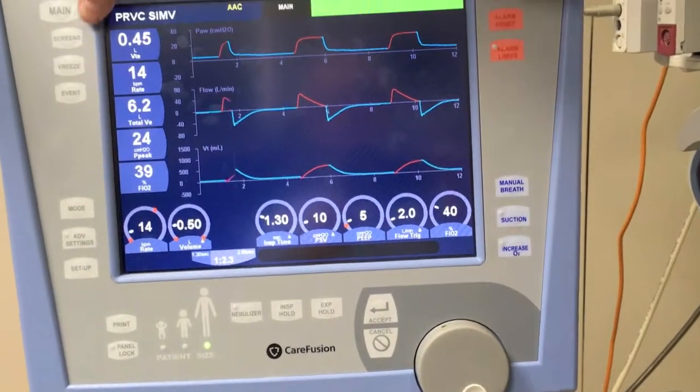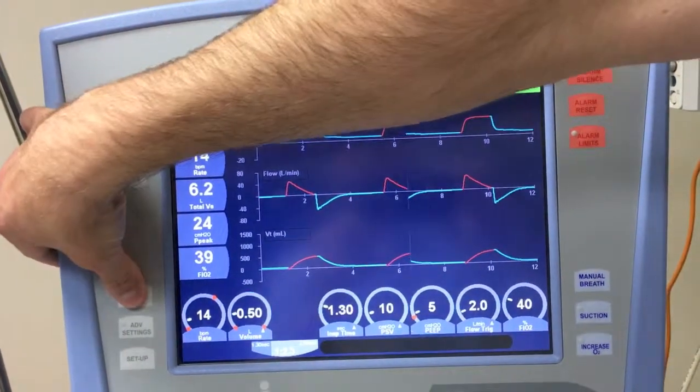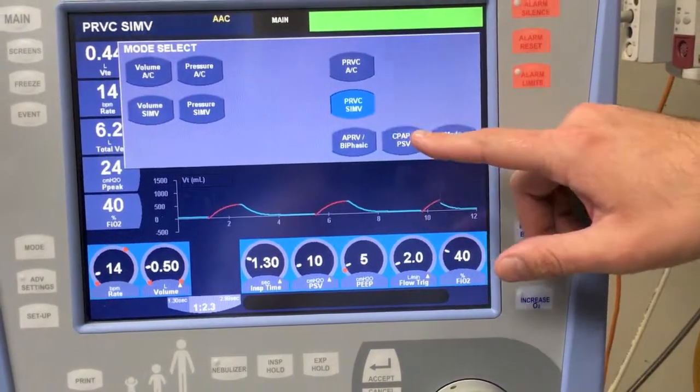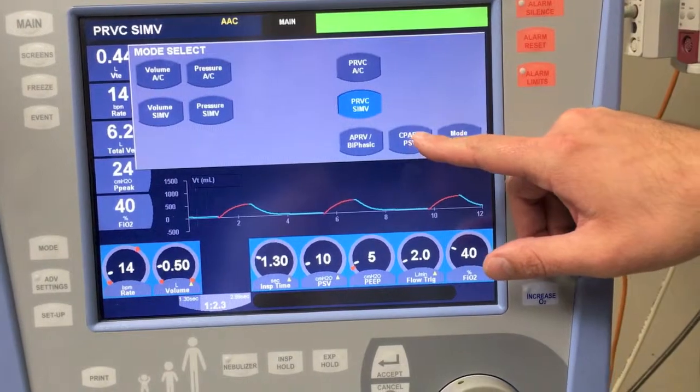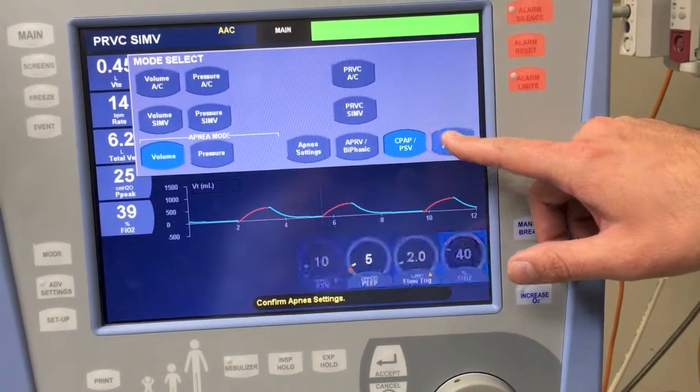I'm just going to put it on standby here to show you how to change the modes quickly. You can just go to modes down here. There's pressure support — the two typical modes we use on this are PRVC and pressure support. You simply touch the button and press mode accept.